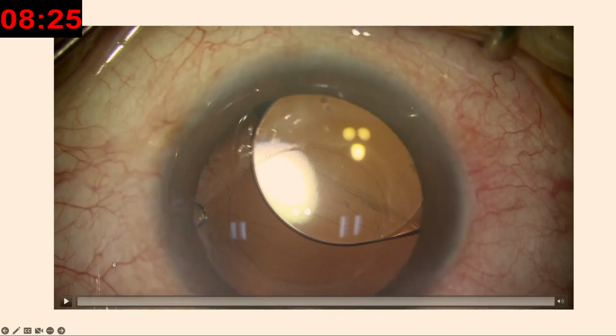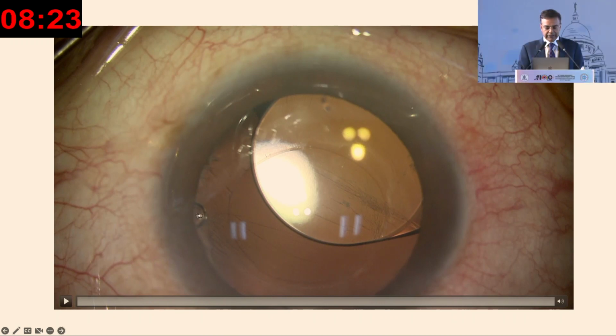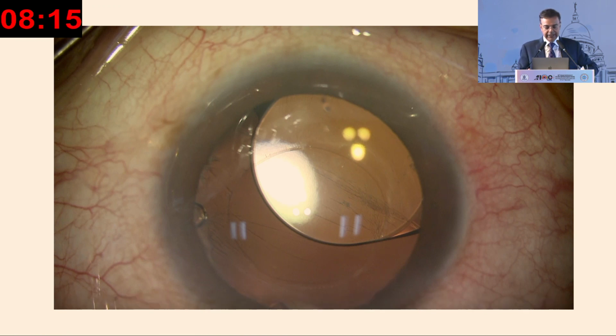Now this was another patient. You can see a small CTR eyelet here and an IOL which has dislocated. For this patient, apparently the bag was already slightly lax, and the patient had been operated a few years back and was doing extremely well for almost 7-8 years. She gives a history of having gone to a doctor and got a YAG capsulotomy done, and post YAG capsulotomy she started seeing double. Her single piece lens, which was in the bag with the CTR, had moved through that big capsulotomy.